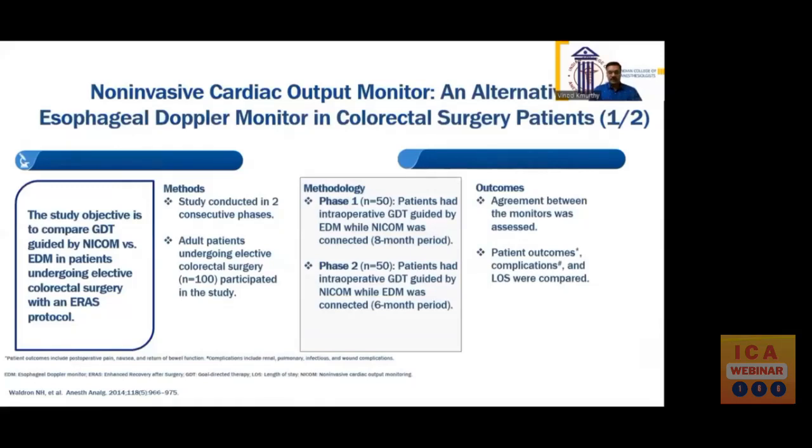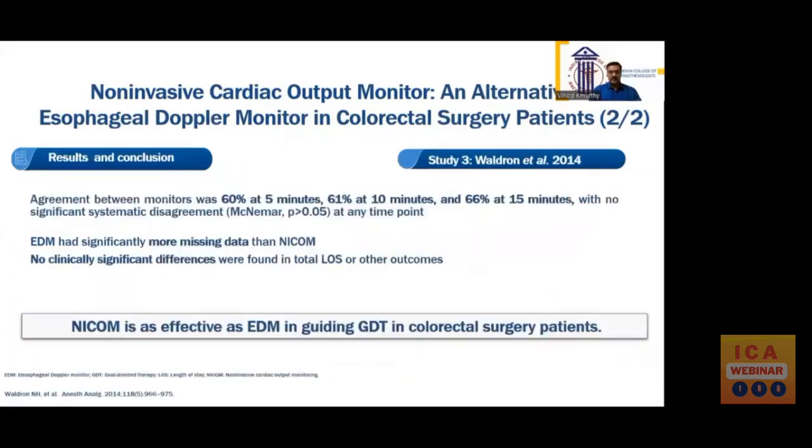This study by Waldron et al. compared the NICOM with esophageal Doppler in guiding goal-directed fluid therapy in patients undergoing colorectal surgery. They concluded saying that the NICOM is as effective as the esophageal Doppler monitor in guiding goal-directed therapy in colorectal patients.